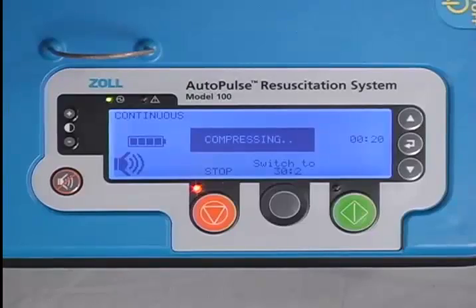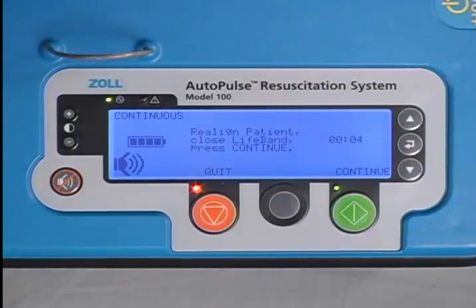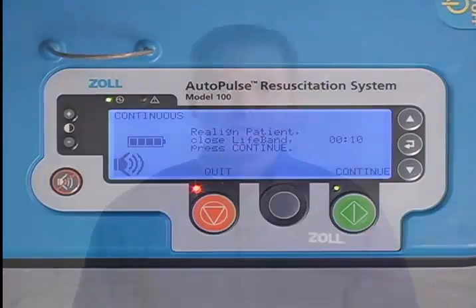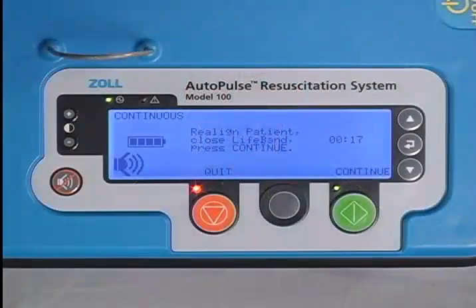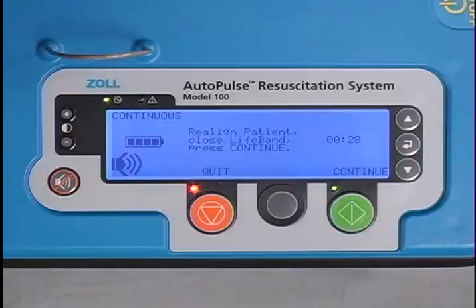To further assist clinicians in minimizing no-flow time, the Autopulse has a pause alert tone as a reminder that blood flow for the patient has been stopped. Once the Autopulse is paused for 10 seconds, a single tone will sound. After 20 seconds of no-flow time, a series of three pause alert tones will sound. After 30 seconds, the tones will sound continuously until either compressions are resumed or the mute button is pressed.